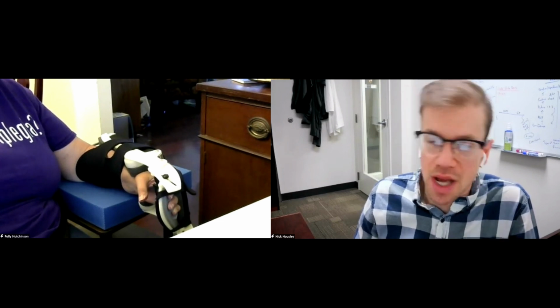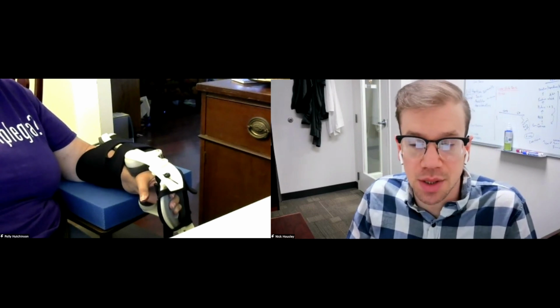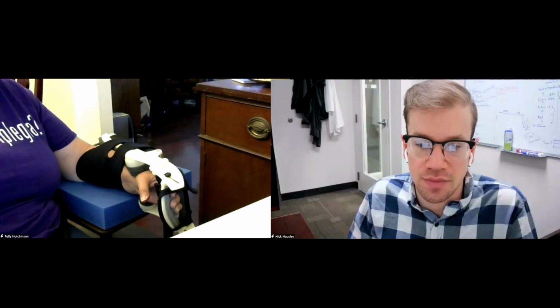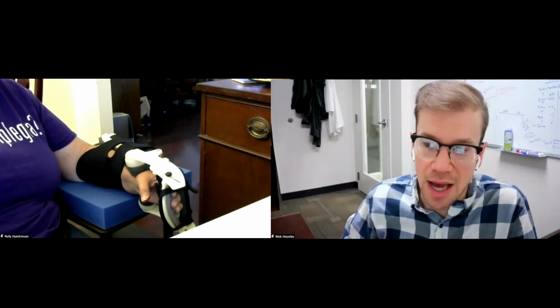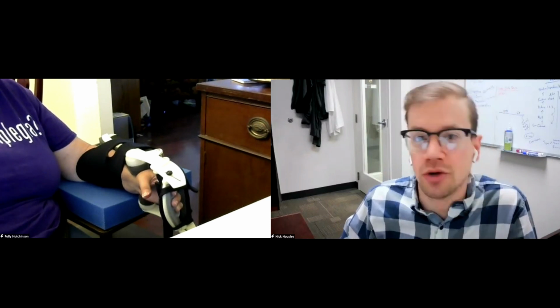But what's nice about that is that it will allow the updates in the background to take place. And so if there are, for instance, some software updates that need to happen to fix a bug that we've identified, that will be able to download in the background. And so that should make it easier and quicker the next time.